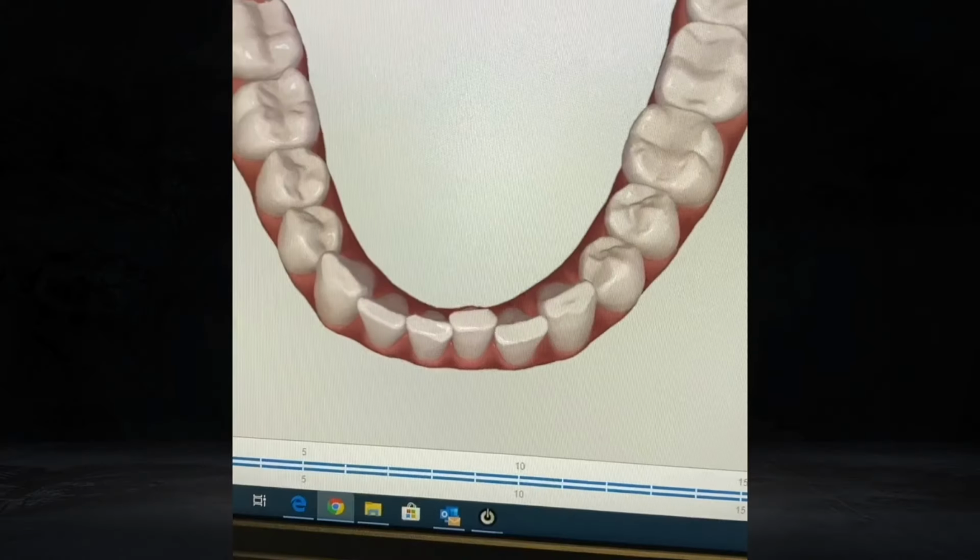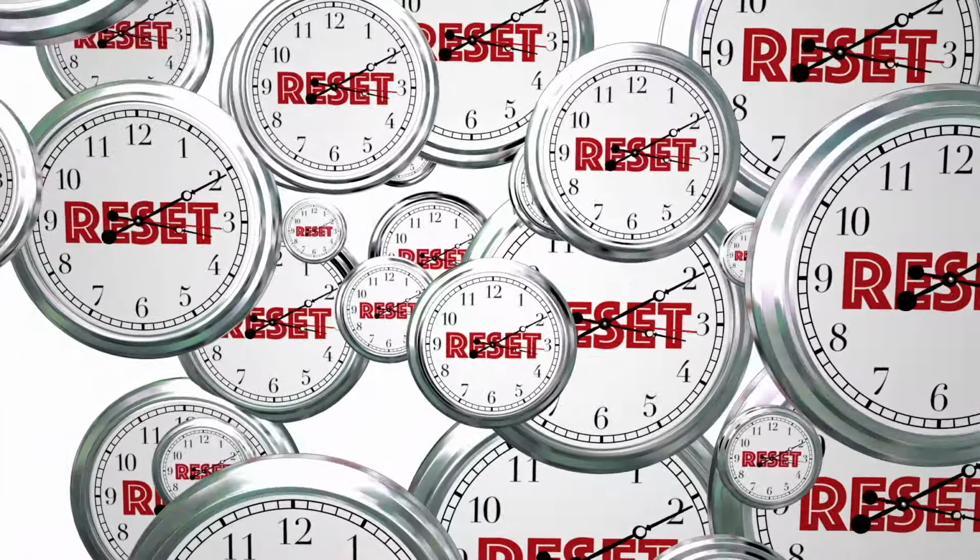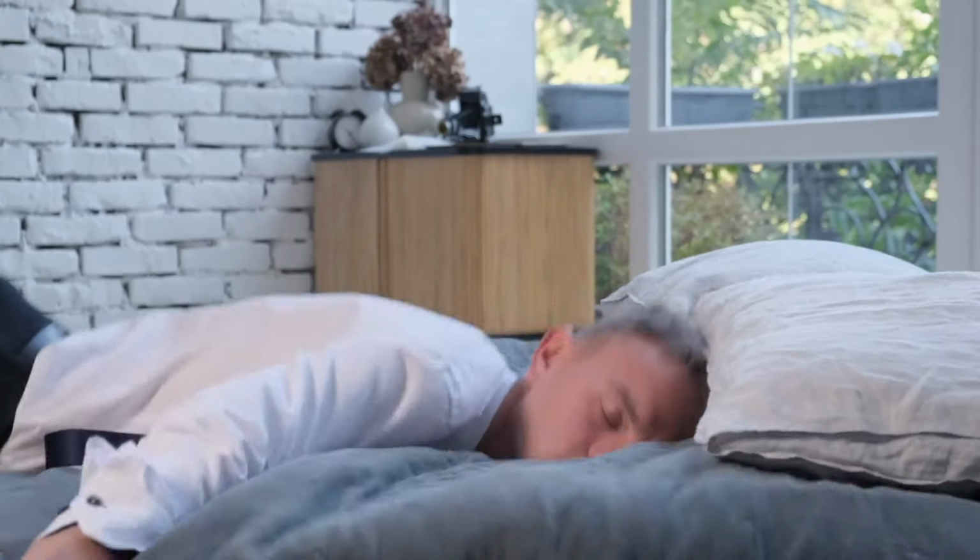The issue is that if you're not in something, your teeth will actually go back to their original positions and you're starting over. So if they said it's going to take 18 months and you go a period of 6 to 10 weeks without an aligner in your mouth, you actually might be resetting that time clock when you finally get around to doing the aligners again. If you miss a night here or there, or you miss a day, it's probably not the end of the world, but long periods of time is when you get into trouble.